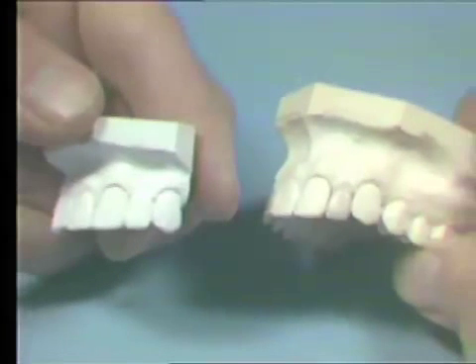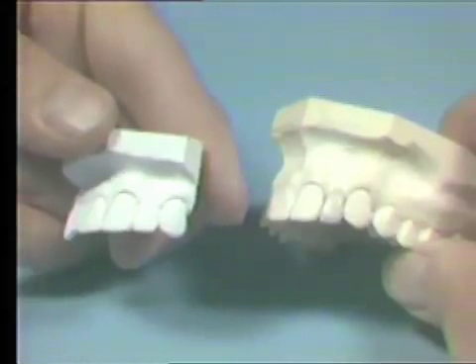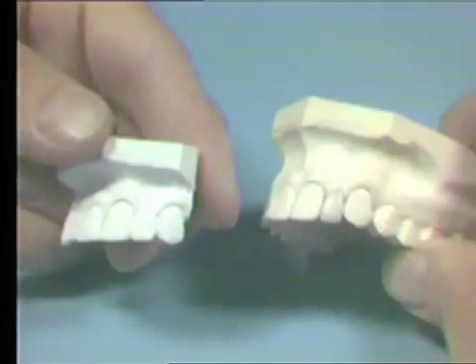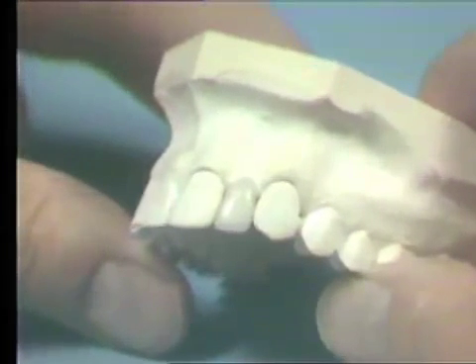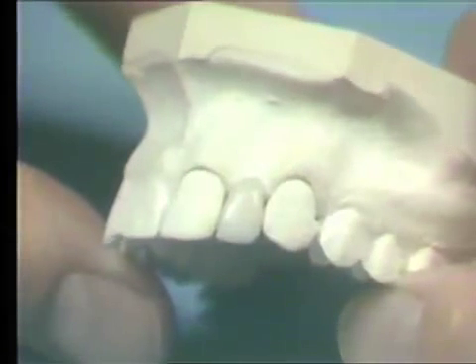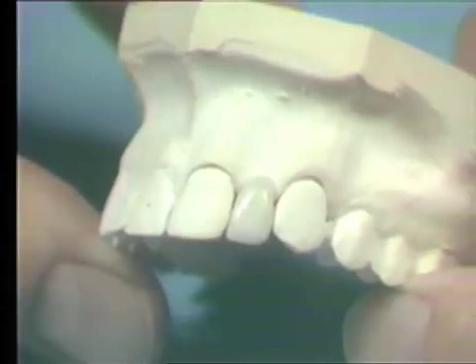Be sure to refer to the stone model you received, as this will aid you in developing the overall contour during the grinding procedure. Remember, the porcelain material is essentially glass and must be handled with a degree of caution. Also, try to maintain cleanliness so that foreign material is not incorporated into the surface of the porcelain.